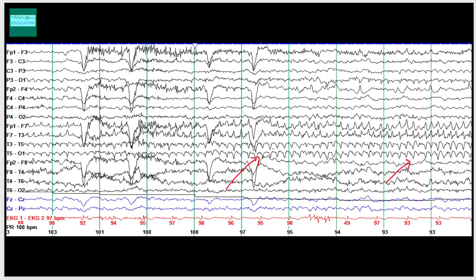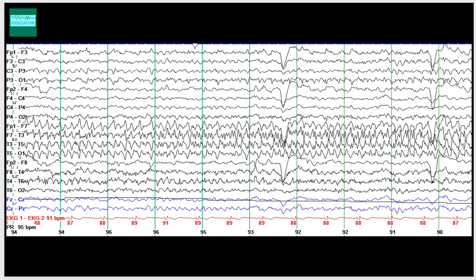You see rhythmic activity predominantly affecting the left hemisphere, the left temporal head region, at a frequency of 6 to 7 hertz, involving four channels. By definition, an electrographic seizure has a clear beginning — which we've seen — a clear end, which we will see, an evolution in frequency, an evolution in amplitude, and an evolution in the number of channels involved. You're starting to see some involvement of the parasagittal contacts, and then there is more evolution in frequencies and amplitude.